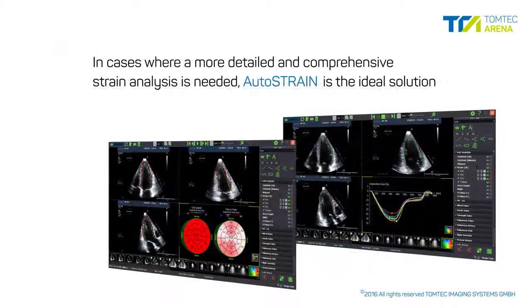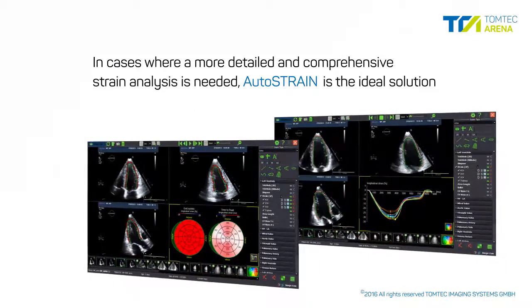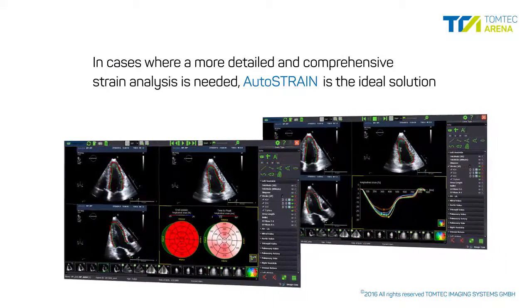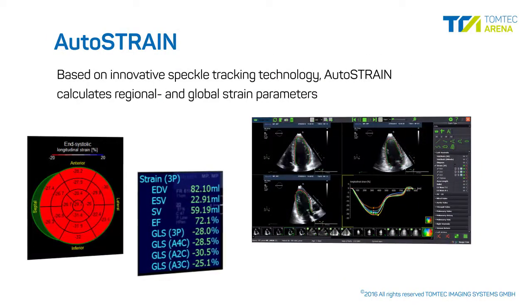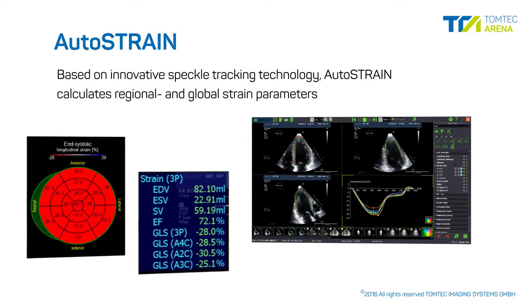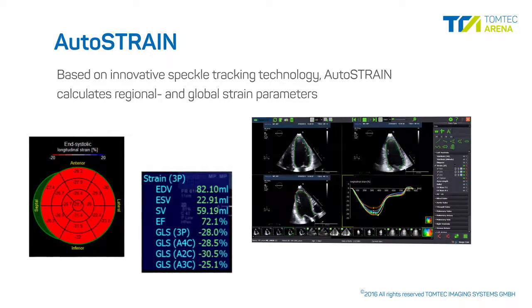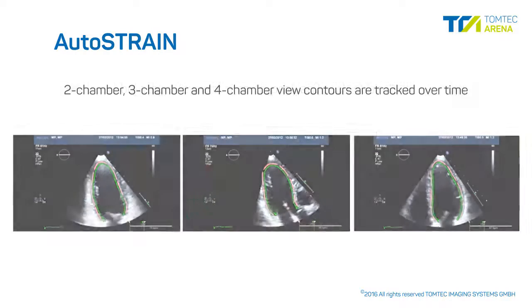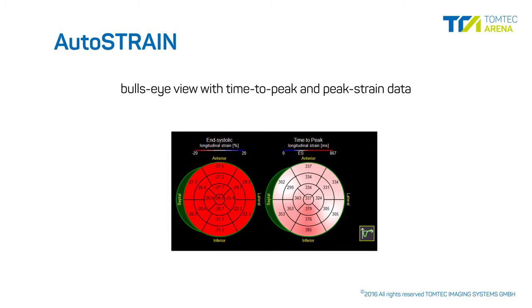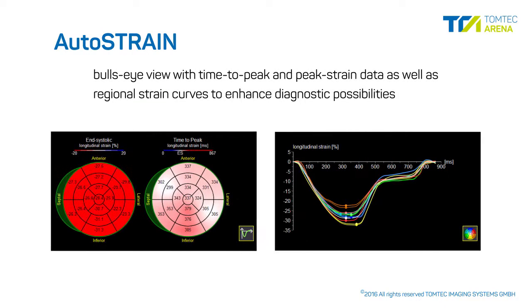In cases where a more detailed and comprehensive strain analysis is needed, Auto-Strain is the ideal solution. Based on innovative speckle tracking technology, Auto-Strain calculates regional and global strain parameters. Contours in the two-chamber, three-chamber, and four-chamber view are automatically detected and tracked over time. Auto-Strain provides a bullseye view with time-to-peak and peak strain data, as well as regional strain curves to enhance diagnostic possibilities in cardio-oncology.